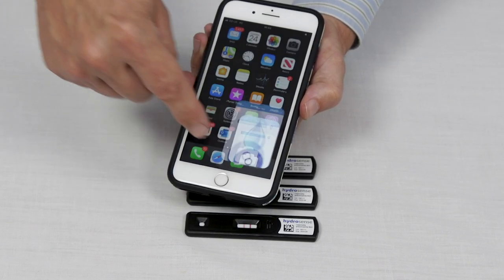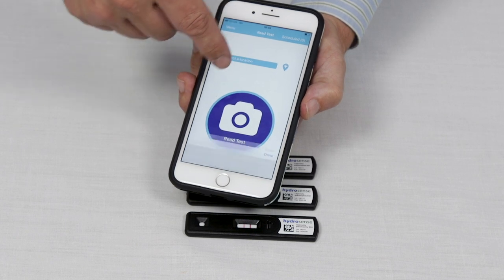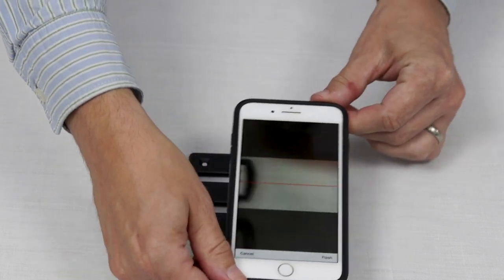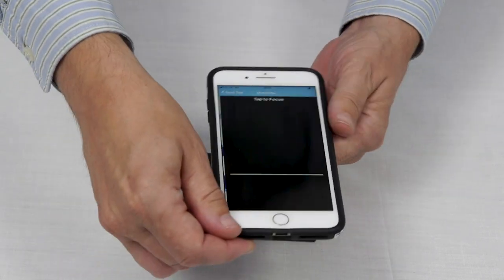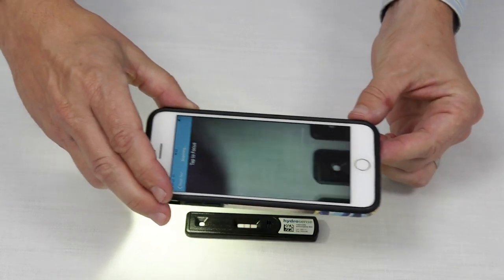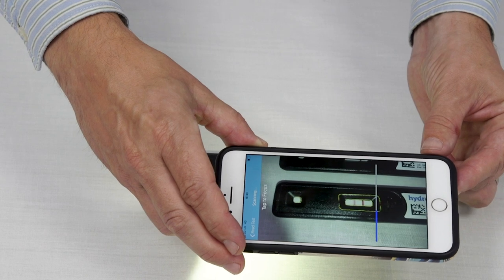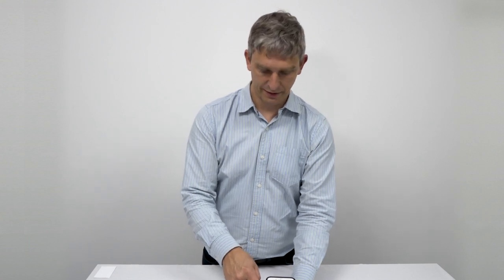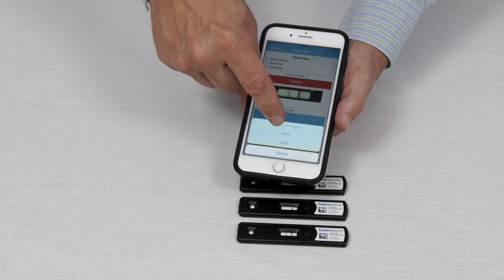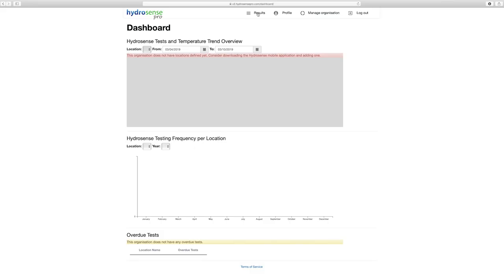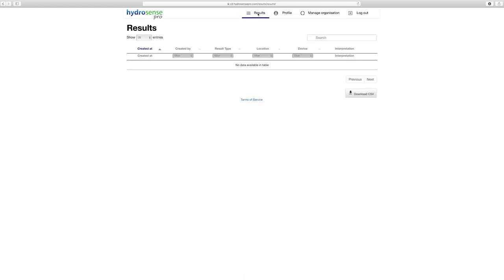To use the app launch the app, select a pre-programmed location and click read test. Scan the barcode and then read the test by matching up the image on the screen with the cassette. The positive result indicates that Legionella pneumophila serogroup 1 has been detected in the sample. Results can be shared via email or SMS or results are also automatically uploaded to the HydroSense Pro portal at hydrosensepro.com.